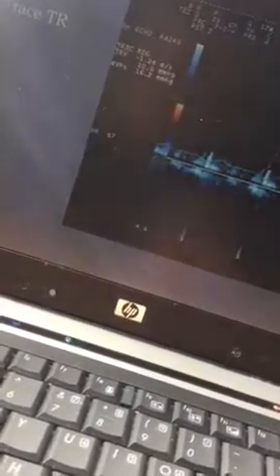In apical 4 and 5, you can also see a little trace tricuspid regurg. The trace tricuspid regurg comes out to 1.24 meters per second. Adding 10 gives us 16.2 millimeters of mercury. On this view, you can see a little bit of the aortic stenosis and the aortic annulus calcification. Both were noted on the report.